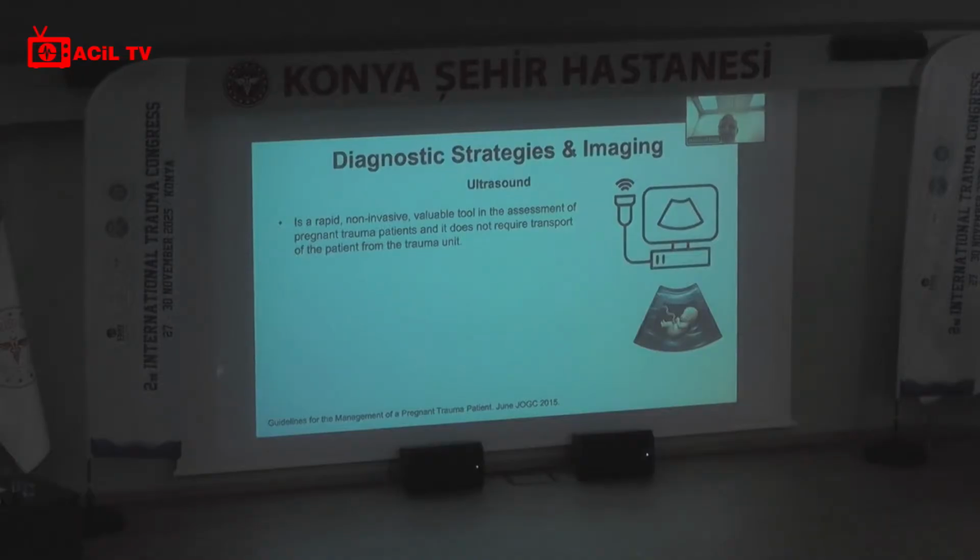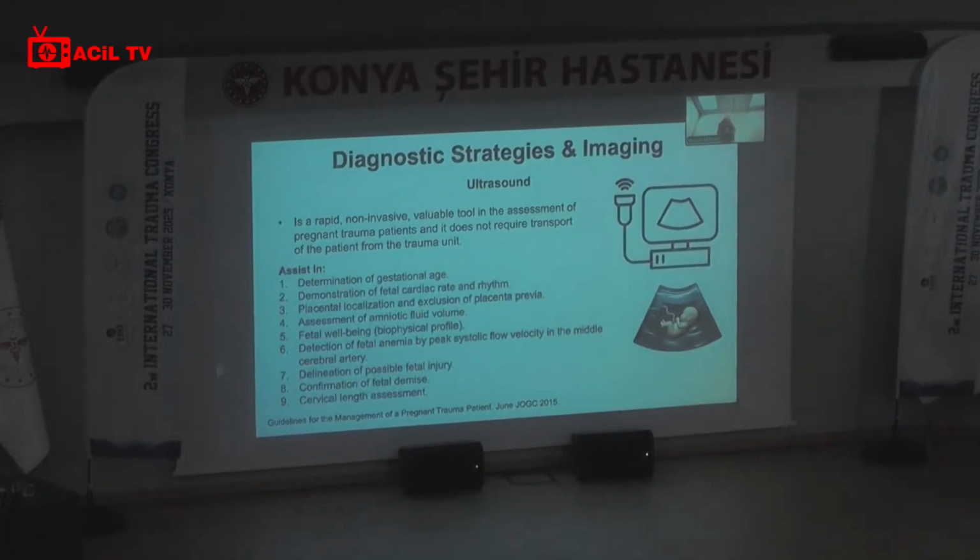The diagnostic strategy is mainly done without radiation, in terms of ultrasound. The main things that we need to concentrate on with the ultrasound are determination of gestational age, and demonstrating that the fetal heart rate is detectable.